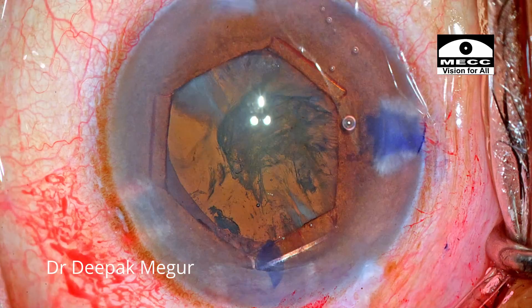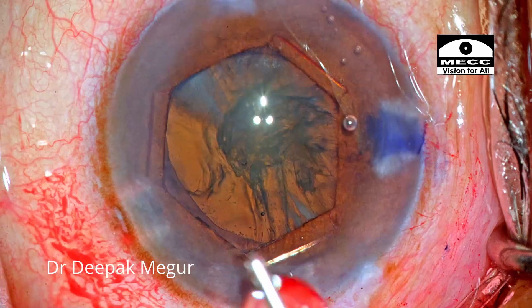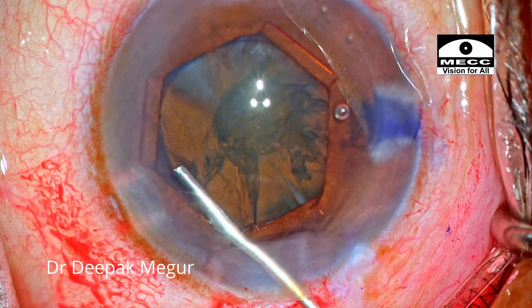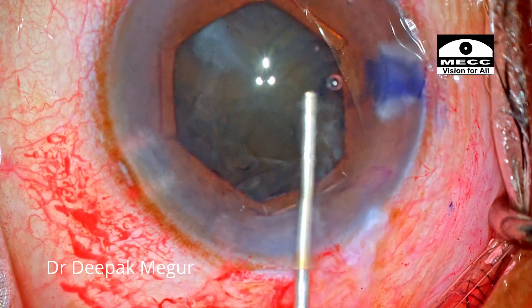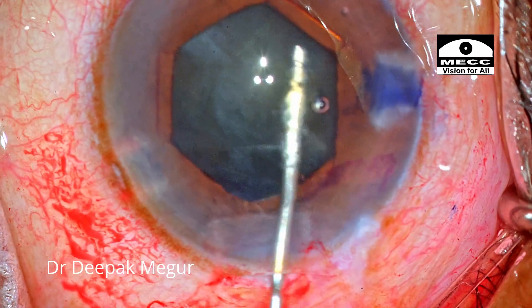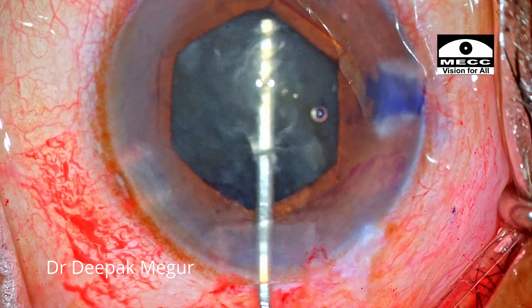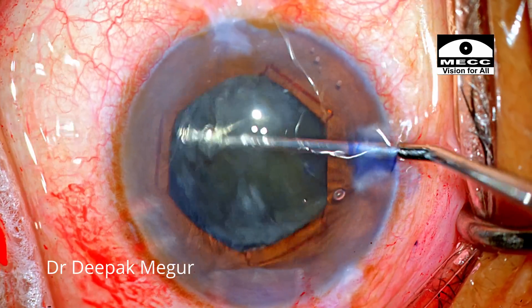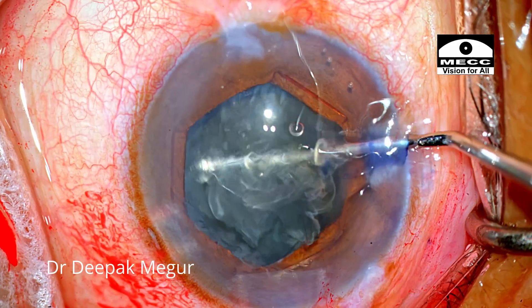In softer cataracts hydrodissection and hydro procedures are extremely important, but I don't want to use large amounts of fluid. I gently decompress to purge out the viscoelastic, then inject a very small amount of BSS under the anterior capsule and see a beautiful wave, immediately decompressing. Thankfully the iris has started to behave well. I check for cortical capsule adhesions and rotate the nucleus once as is my habit. Time to do phacoemulsification.